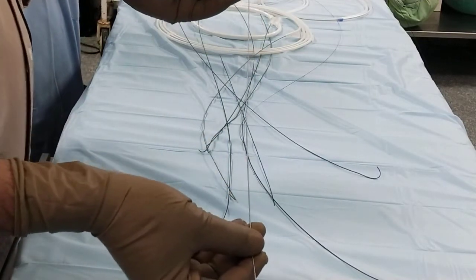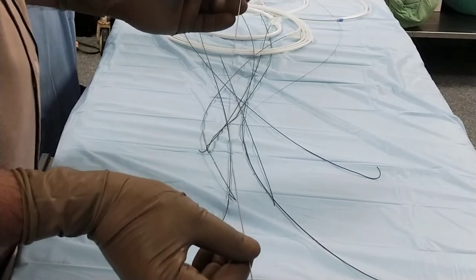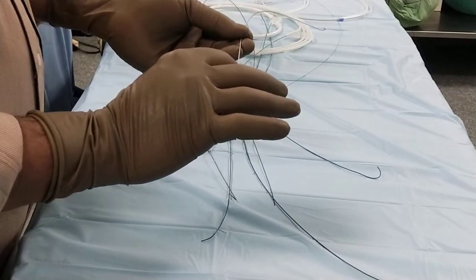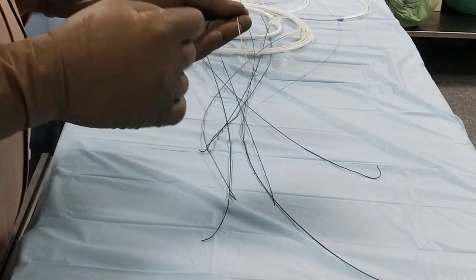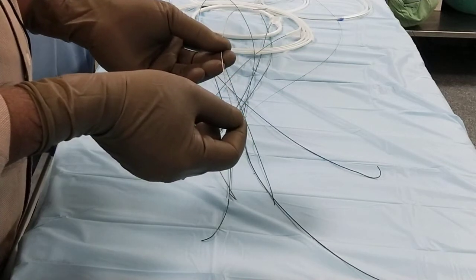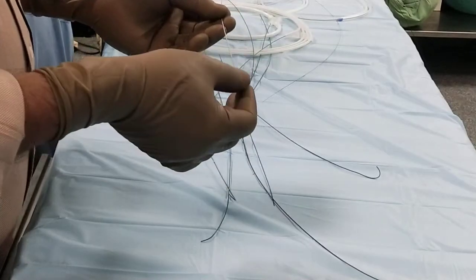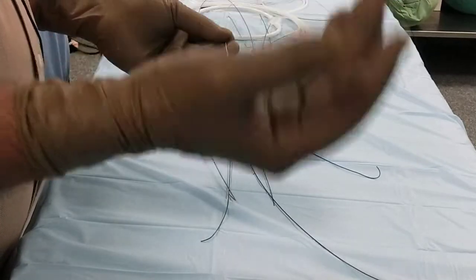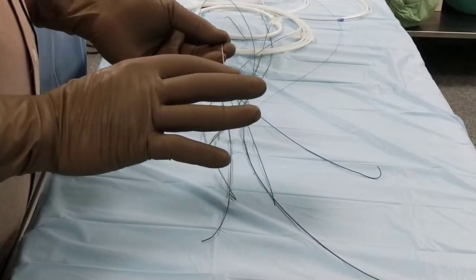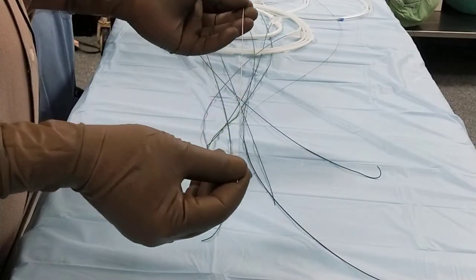The thickness of the guide wire is in inches — it is 0.038. It can go lesser than that, down to 0.008 or 0.006 inches, but we rarely use those. In neuro vessels we use those guide wires. Here we are using a 0.038 inch guide wire for the initial access in the femoral artery.